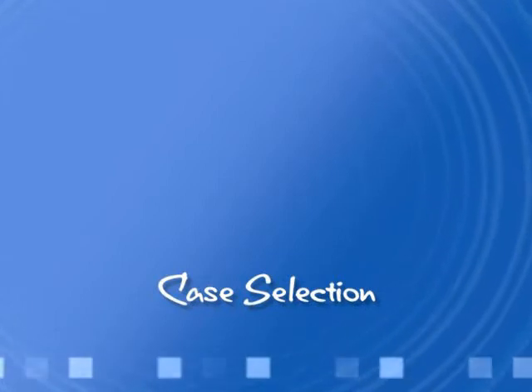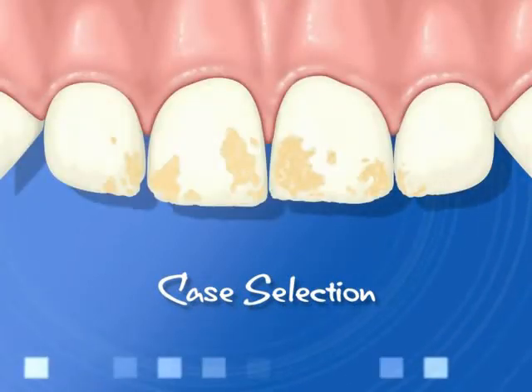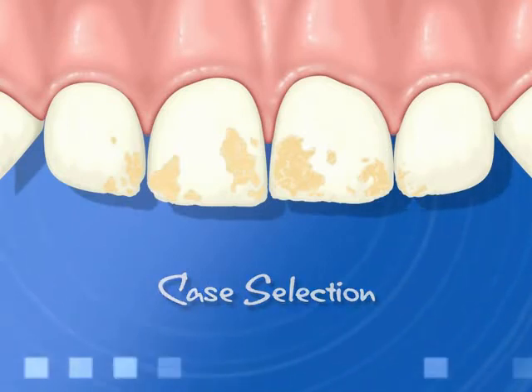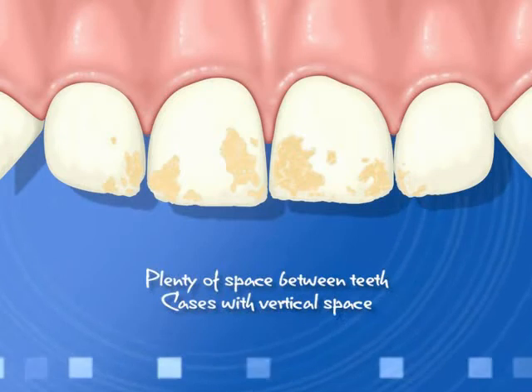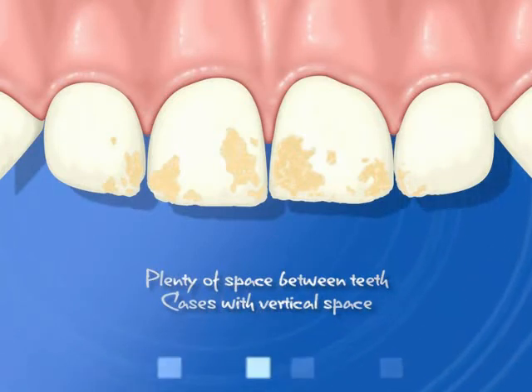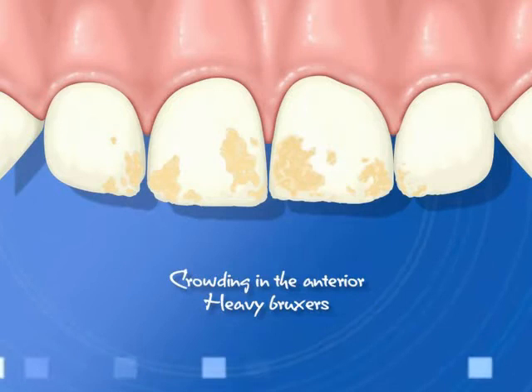Case selection. Choosing the proper case, especially when you're first starting out, is crucial. If you have not used any prefabricated crowns of this type, we recommend choosing cases with plenty of space between teeth and cases with adequate vertical space. Cases that would not be good candidates would be cases with crowding in the anterior and heavy bruxers.